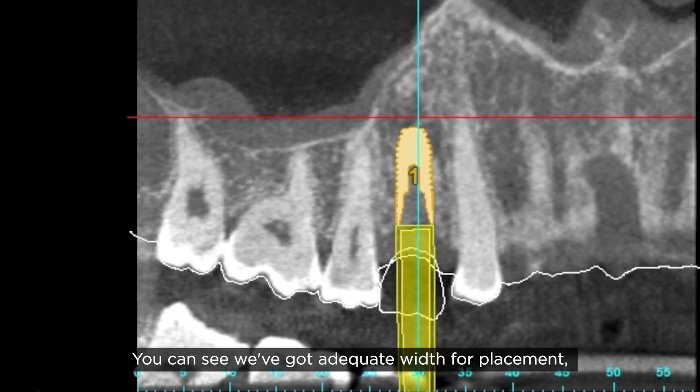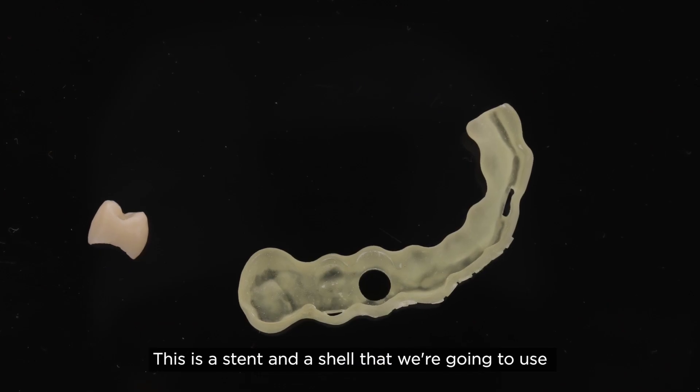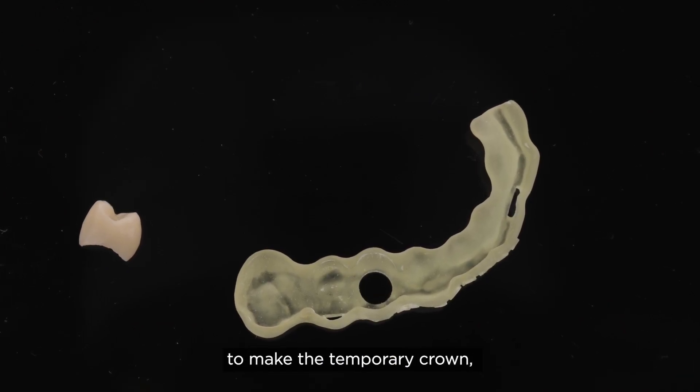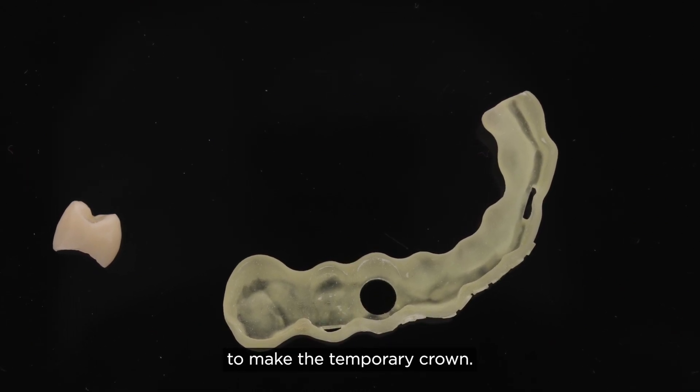You can see we've got adequate width for placement as well as adequate height. This is a stent and shell that we're going to use — the stent to position the implant and the shell to make the temporary crown.